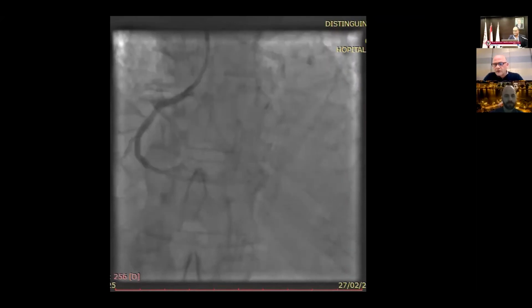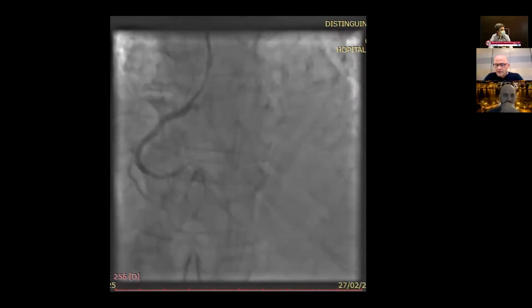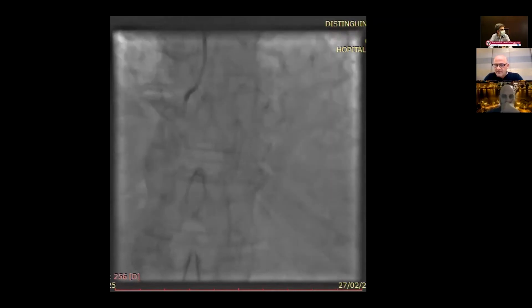Good evening, dear colleagues. In retrospect, I have a few comments. For sure, a great case. Thank you, Radi, for your achievement. In retrospect, not all centers have rotablator. This is a case with heavily calcified coronaries. It's obvious the RCA is, even on fluoroscopy, appearing calcific. So this is definitely a heavily calcific lesion.